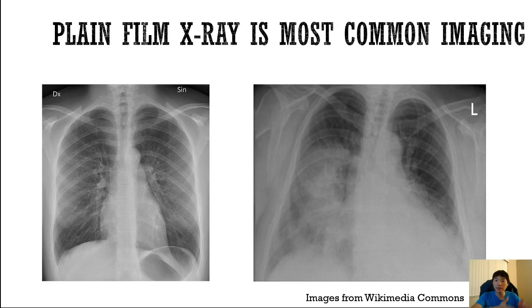We see the spine down the middle, but we also see the two lungs. And the two lungs show up a little bit darker than the rest of the image because the lungs are filled with air, and the air is much less dense than the rest of the body, and so it tends to reflect and absorb and scatter less of the X-rays.